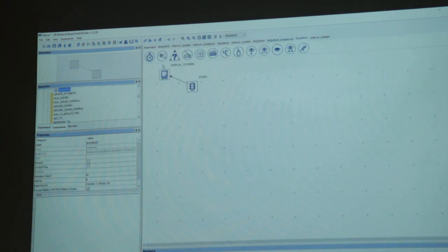Okay, so I will quickly come to the eye movement triggers. It is the important part here. Now, when you have added objects on your screen, you have your interest areas. Now you want to detect a saccade to that interest area. If it lands within the interest area, you have to mark it correct. If it does not land in the interest area, you want to mark it incorrect.